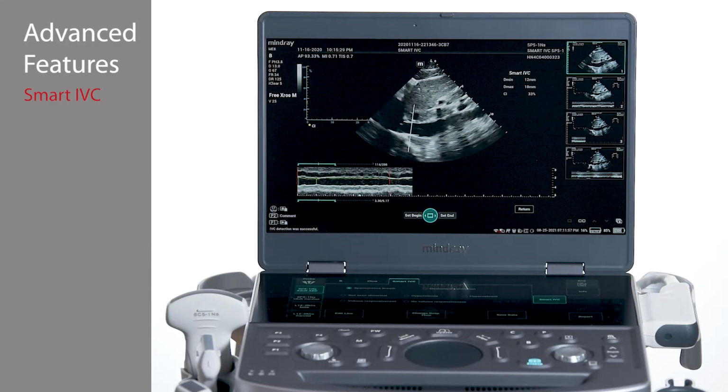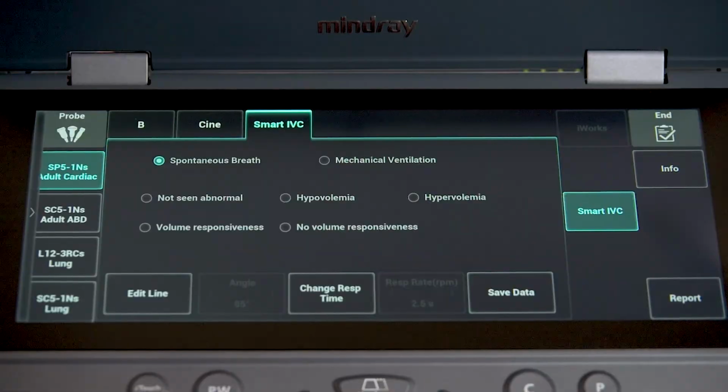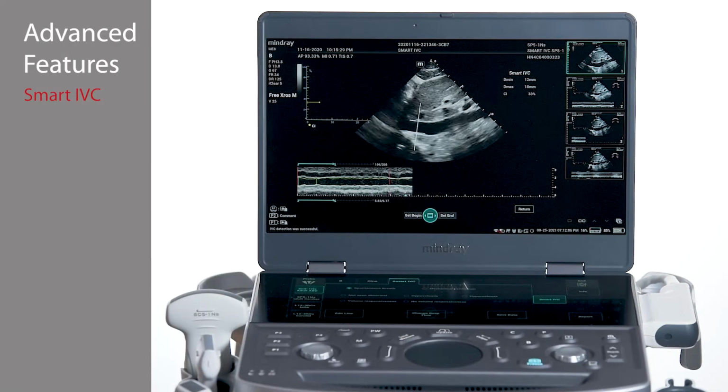Smart IVC will automatically calculate the respiratory cycle, but it can be edited by selecting the Change Respiratory Time tab, which is located on the bottom of the touch panel.